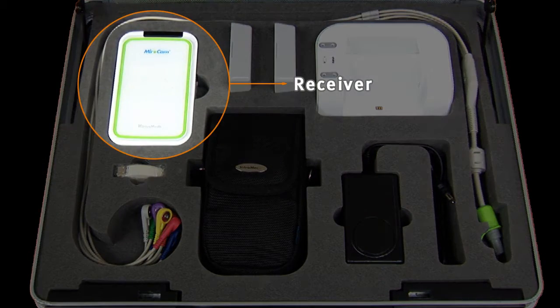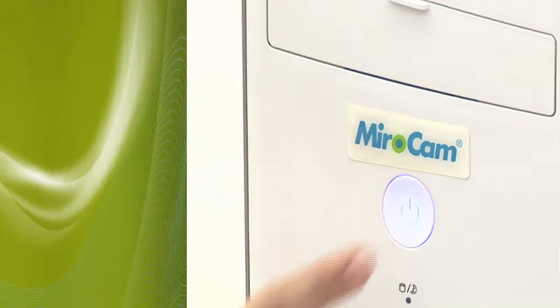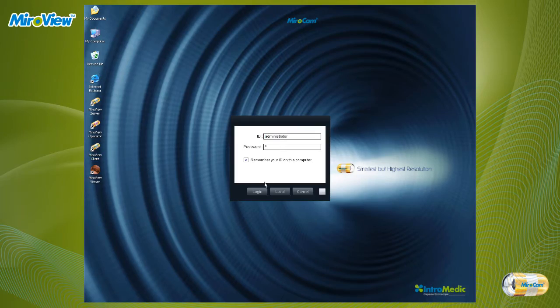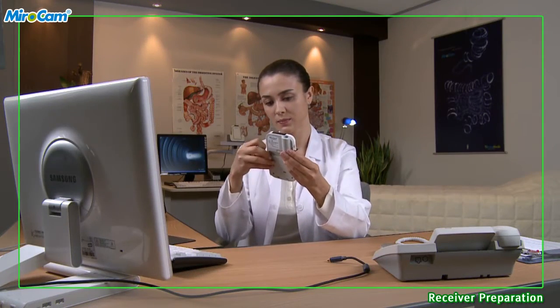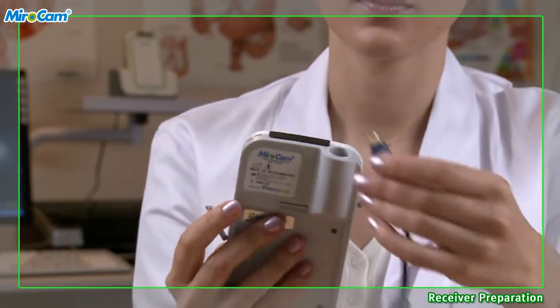Receiver Preparation. The nurse or medical practitioner should turn on the computer, start MiroView Operator, and log in. Connect the receiver to the computer via USB cable and make sure the receiver is turned on.